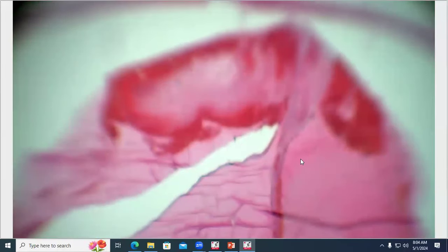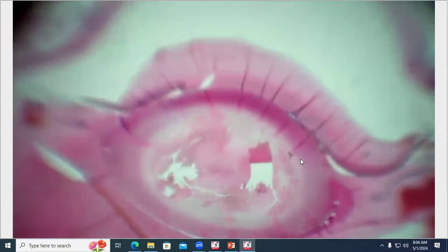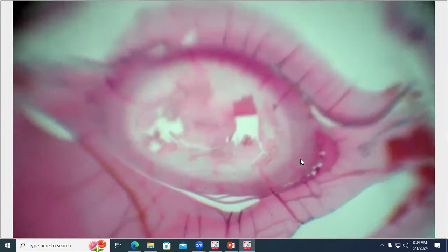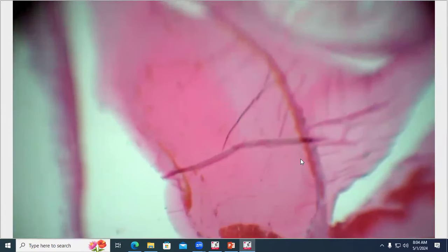All right, here's our slightly closer subgross. Let's flip this globe right way up. This is still going to be difficult to use because only the stuff in the center is in focus, and this is a very large globe. So we have our lens, we have all of this hemorrhage in the globe, with erythrocytes here in the bright red, but a lot of the background is just this pinkish, somewhat homogeneous fluid. So again, a very high protein fluid inside this globe admixed with the hemorrhage.